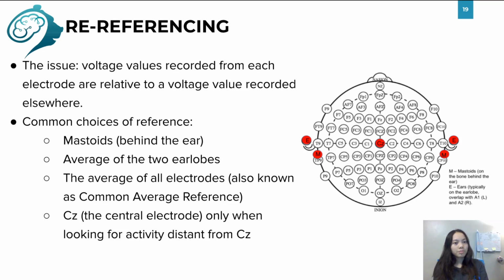For a large number of electrodes, or if electrodes are placed on the neck and face, an average reference is often recommended. Referencing to one lateralized side is not recommended because this will introduce a lateralization bias in the data. So the reference electrode should not be close to an electrode where you expect your main effects.